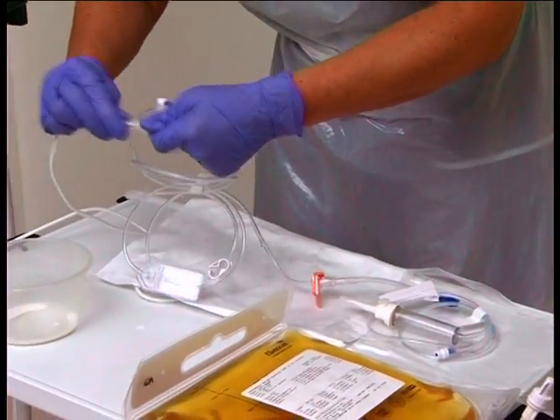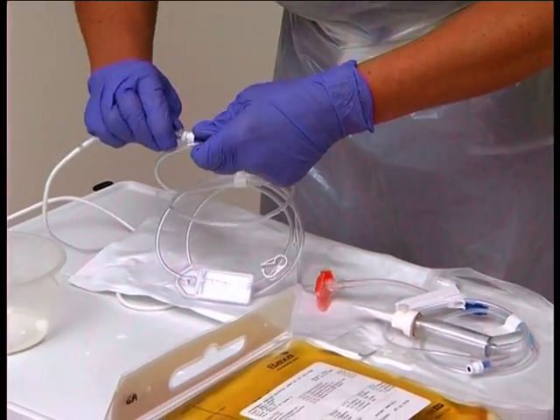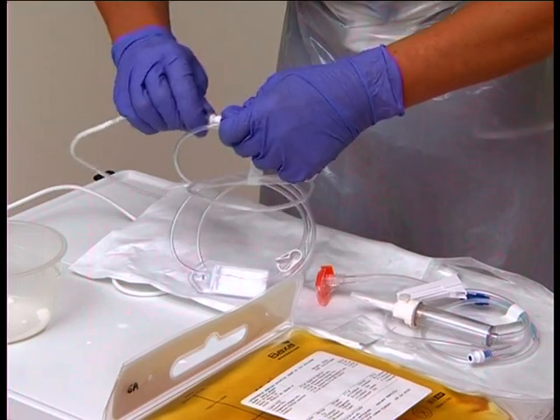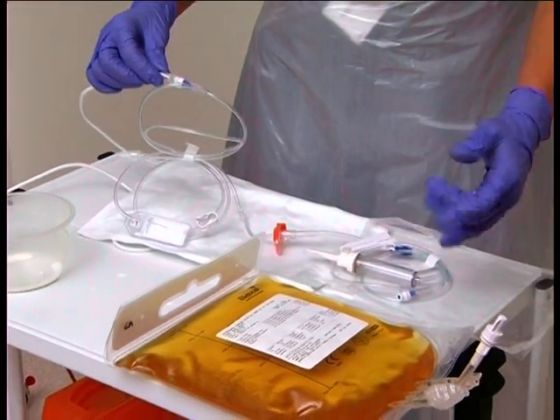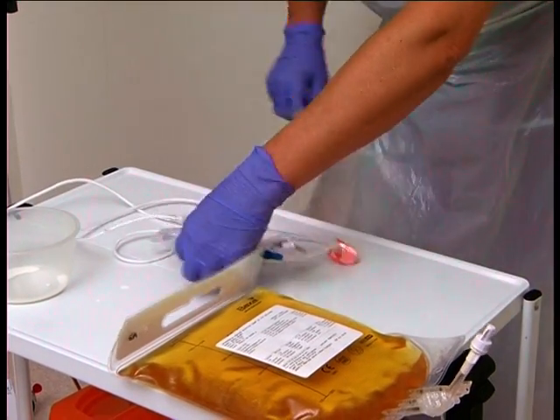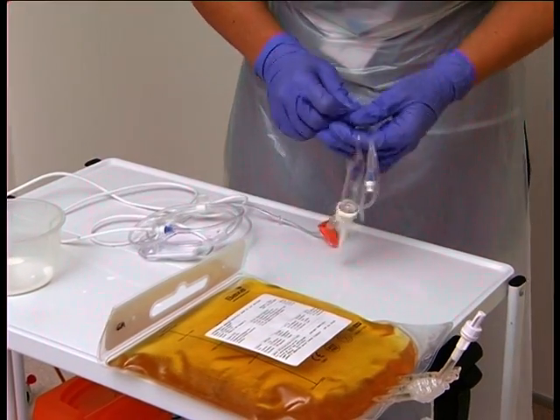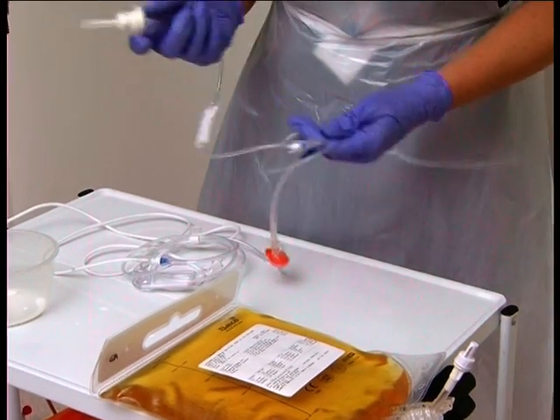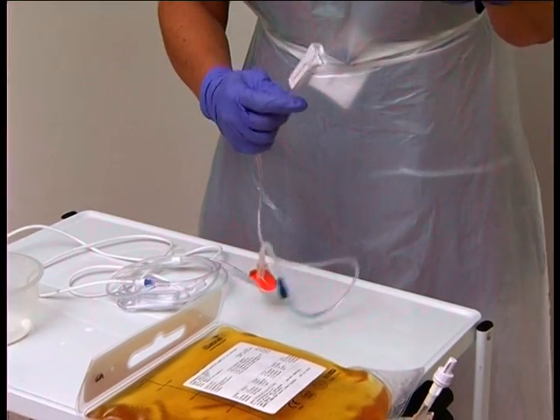Taking care not to touch the key part and using a two-hand technique, remove the cap from the end of the fat infusion giving set and join it to the filter set. The remaining smart site is not a key part in this situation because it is not being used. Remove the paper ties and make sure that the sets are not tangled. Close the roller clamp.